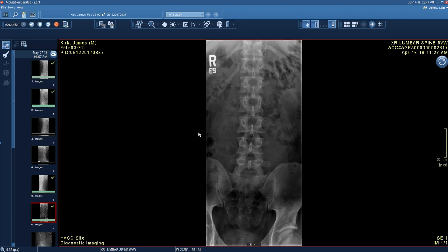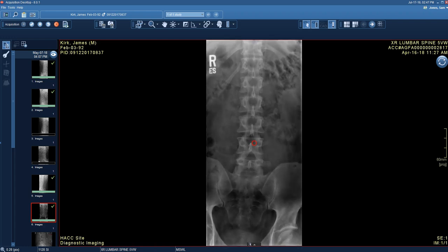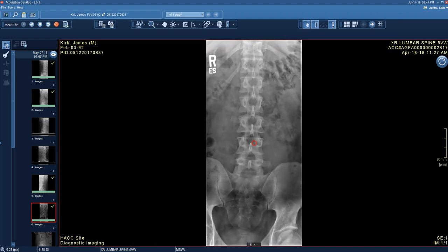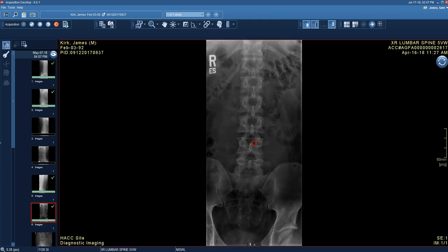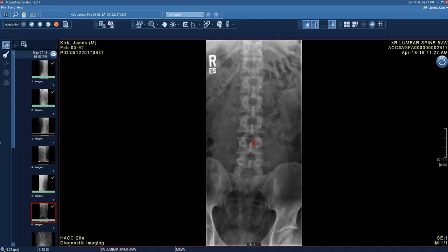Let's bring the AP view back up and talk about the three major tools. The first is window level, which corresponds to brightness and contrast — it's the most important tool. To use it, right-click, hold down the right mouse button, and move the mouse in a circle. You can change the brightness and contrast — what we call window and level — until you have the image in an optimal viewing pattern for your eyes, your lighting, and your monitor.